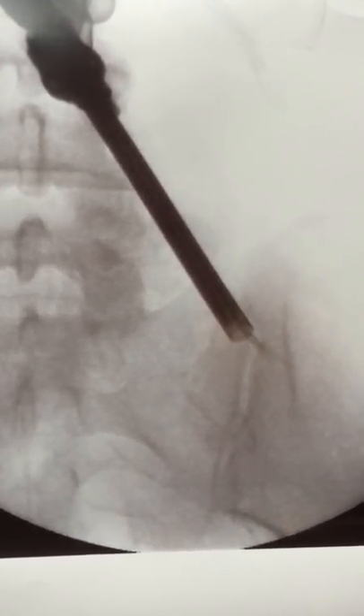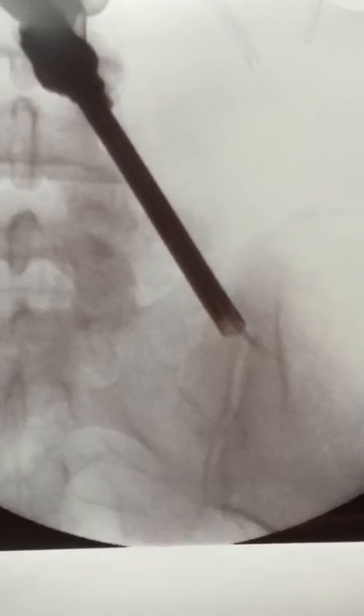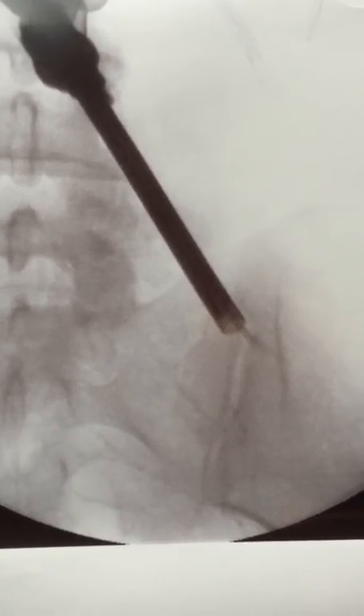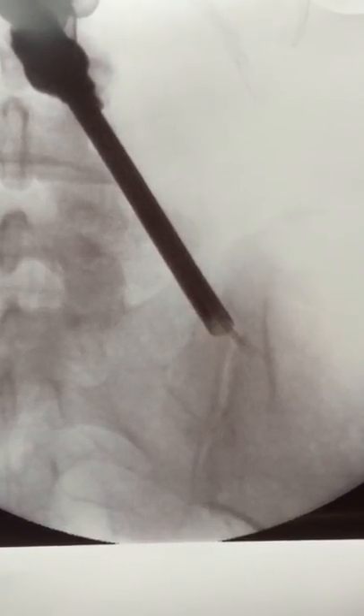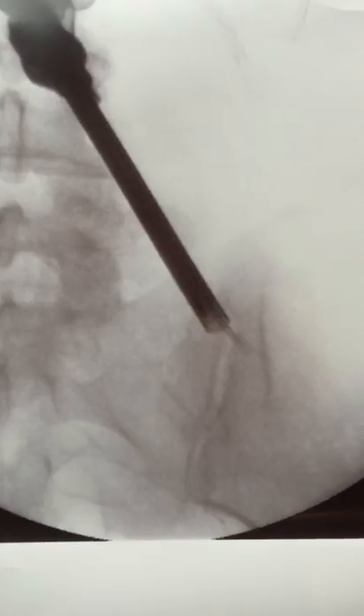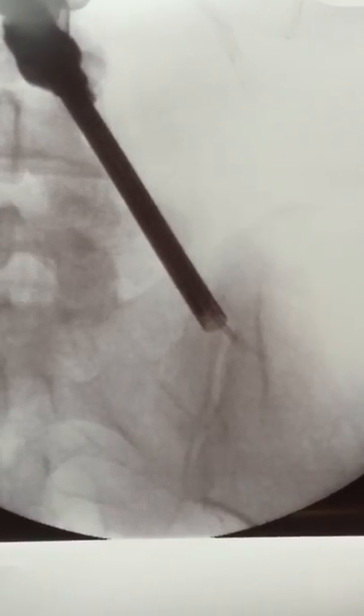In this picture you see the tip of the rhizotomy device deep within the joint, so this way you produce a superficial and deep ablation which is most complete. We're doing this to achieve the best result possible.